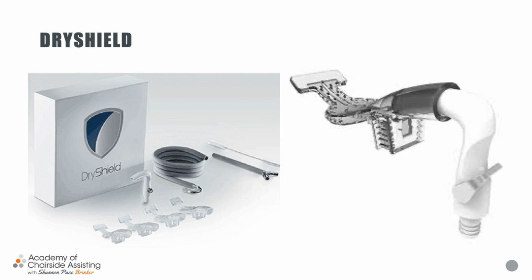I like the fact that this little white end that you would pop on your mouthpiece was really nice and smooth. It sat up higher, which I think was a perk. I also like that it was slim. It stood up higher whenever we would sit it into our holder. That was nice.